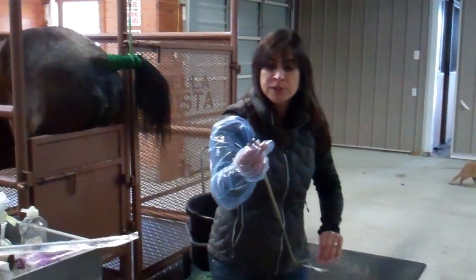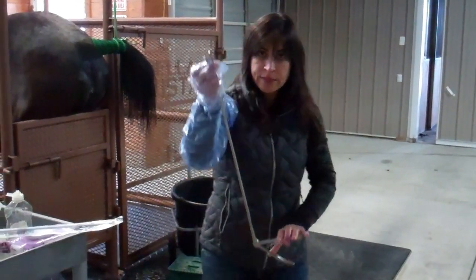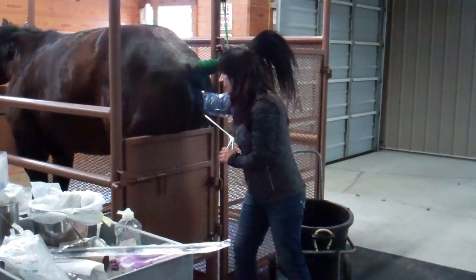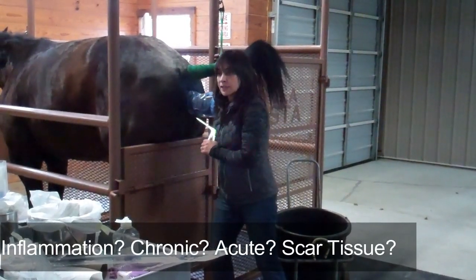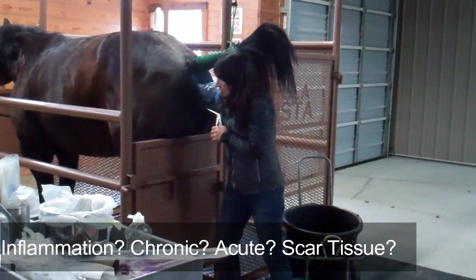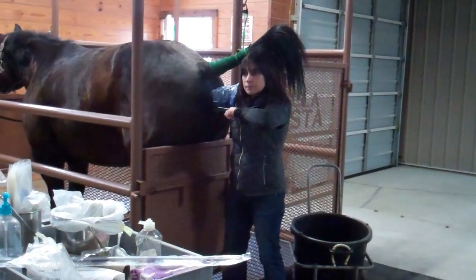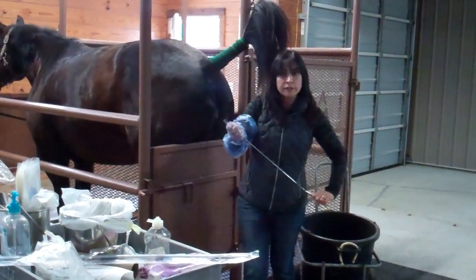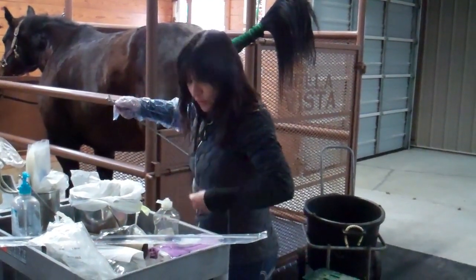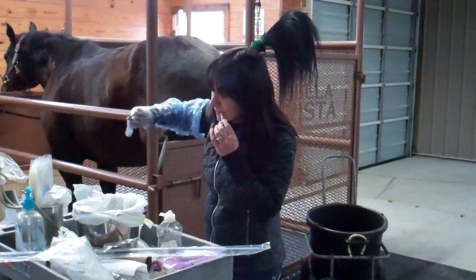This is a very simple procedure. There's a little basket here, and I'm going to go in and take a little bite — a little tissue sample — from her uterus and send this to the pathologist. They will read the biopsy and tell me if the mare has inflammation, if the inflammation is chronic or acute, and if the mare has scar tissue. On the report I get from the pathologist, I'll be able to know what the chances are of that mare getting in foal and carrying it full term. It's really inexpensive compared to the cost of breeding a mare more than once and not getting a foal.